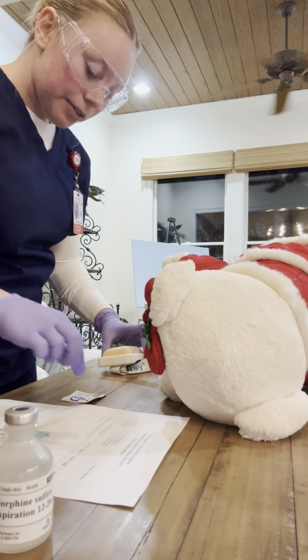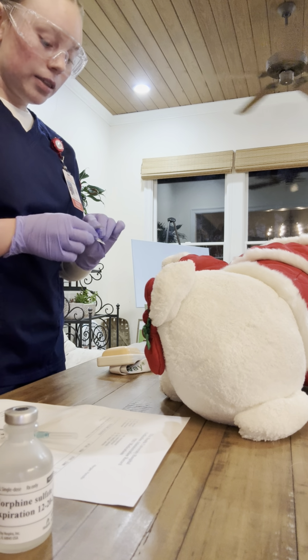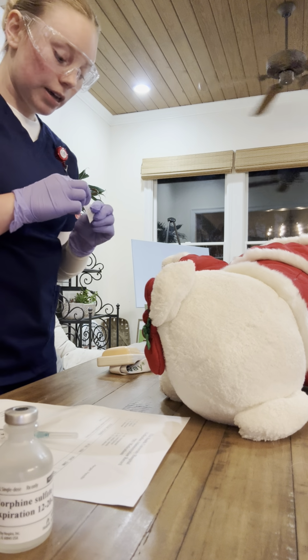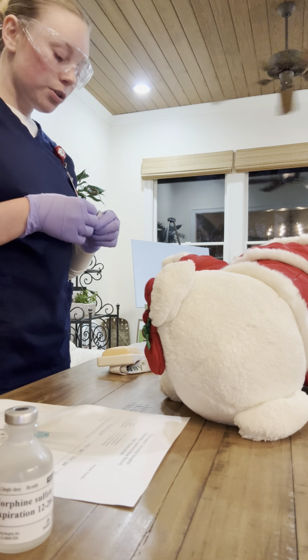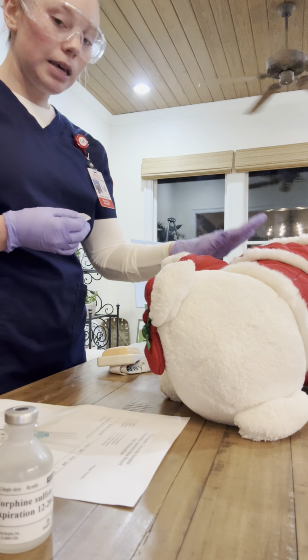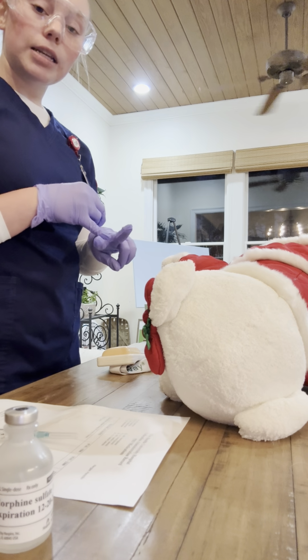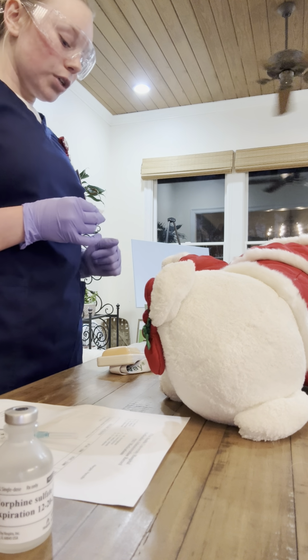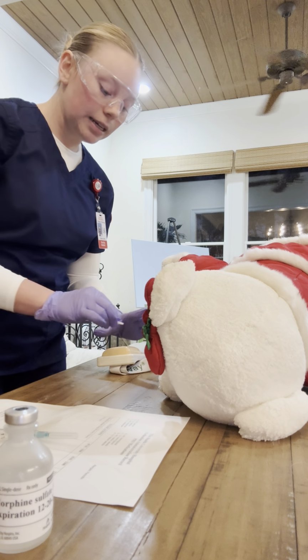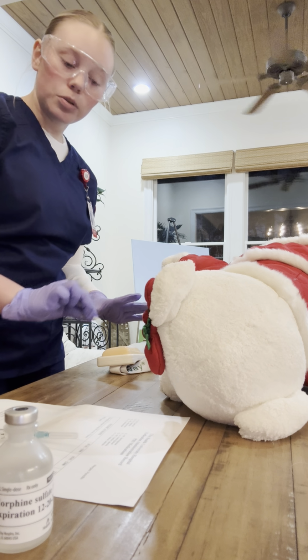All right, Mr. Jones, I'm going to get ready to inject, all right? So I'm going to clean the site. The site that I'm going to be injecting is the ventrogluteal site, so I'm going to make sure to identify the landmarks of that site. For the ventrogluteal, I would locate the greater trochanter, which is right here on the hip. I would locate the iliac spine and the iliac crest, and I would use the V method and inject the needle in the center of the V. I'm going to clean the area that I'm going to be injecting, starting from the innermost portion and moving outward to the outermost portion.